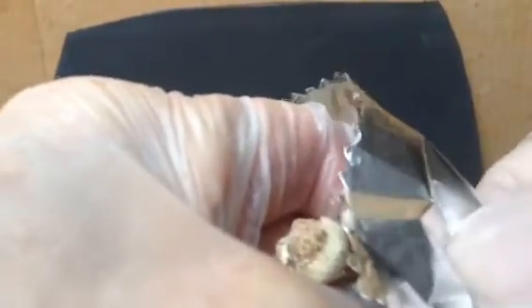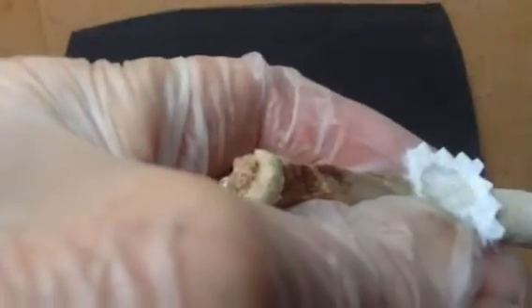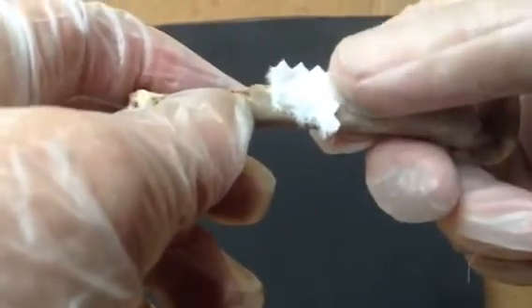Now this could be removed within five minutes, and that will give us an initial setting. Now it's coming off very nicely — that was only about one minute. And now you see that tab is now set, and it's holding the two pieces of bone together.